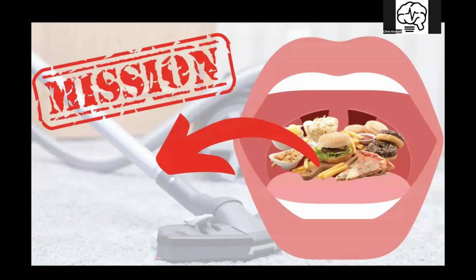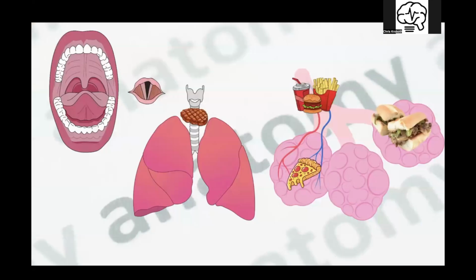And the mission of suctioning is to get junk, food, the buffet, whatever the person ate prior has vomited up out of their airway. Blood, you name it, right? Chunks of nastiness. Because if we don't, it's going to make its way down the airway, go down the trachea and get lodged and prevent any airflow into the lungs, or get aspirated down into the alveoli or the bronchioles and inhibit gas exchange and cause problems with our ventilatory process. And we need to get it out.